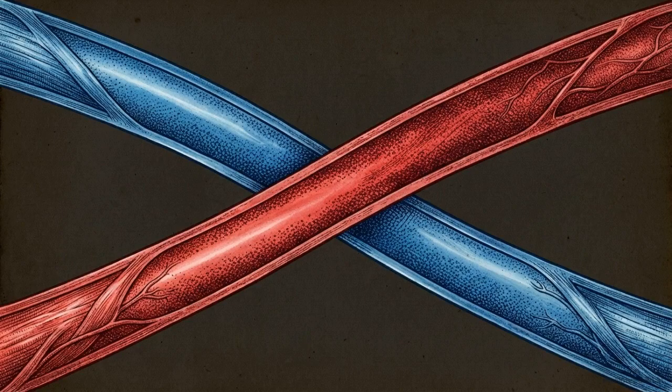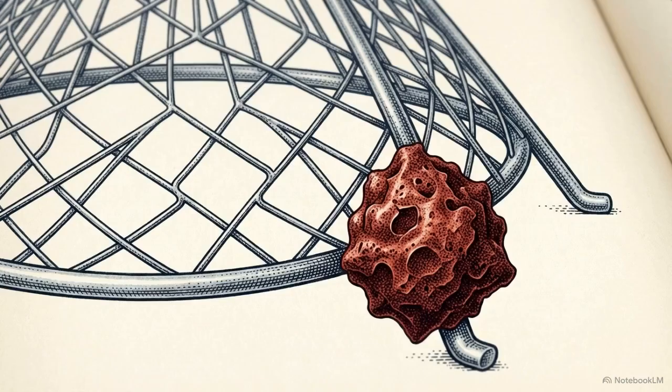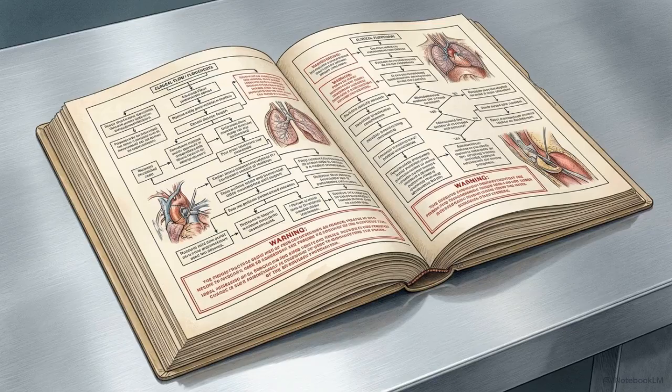This visualization shows the hidden cost. While the risk of pulmonary embolism slopes downward, the localized risk of deep vein thrombosis rises sharply. Deep vein thrombosis is a clot that forms deep within the venous system, typically in the legs. The hardware solves an acute physiological crisis by introducing a new, long-term thrombotic risk. This ongoing localized risk necessitates strict removal protocols.